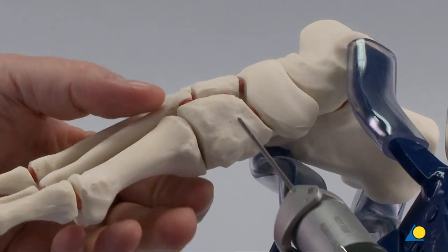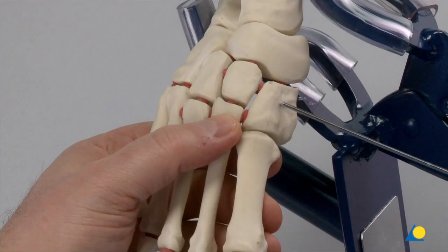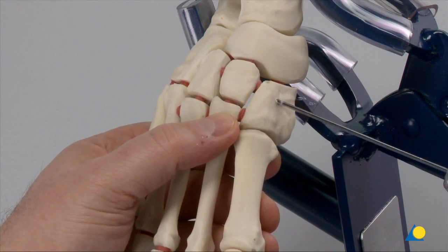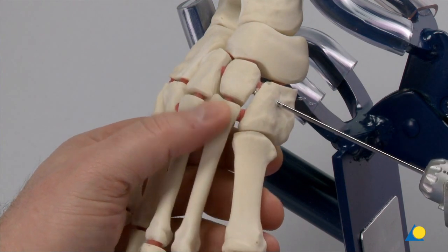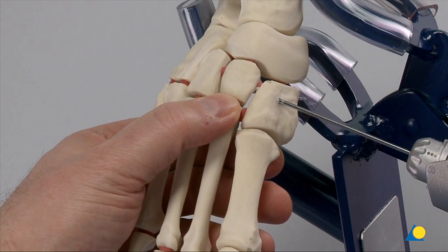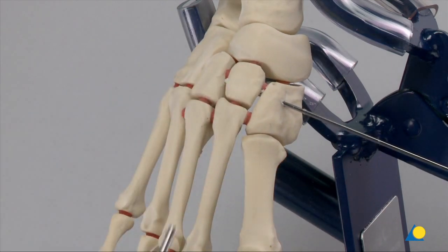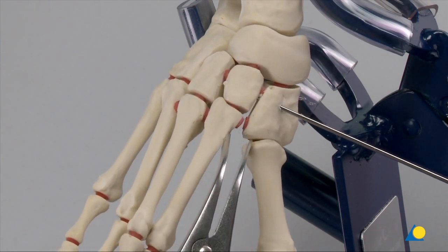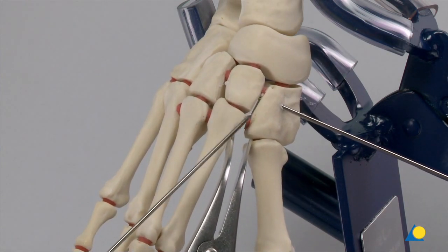In the case of intercuneiform instability, a K-wire can be inserted for provisional stabilization before the definitive ORIF is performed. The K-wire is inserted from the medial cuneiform and directed rather dorsal because there are a number of structures more plantar that should be avoided. The K-wire has addressed the instability between the cuneiforms but not the Lisfranc instability.